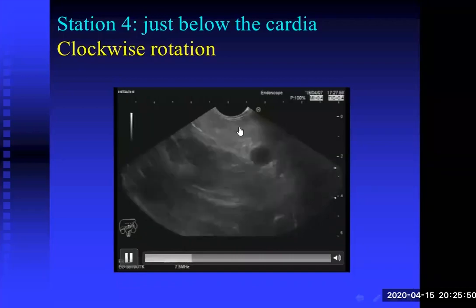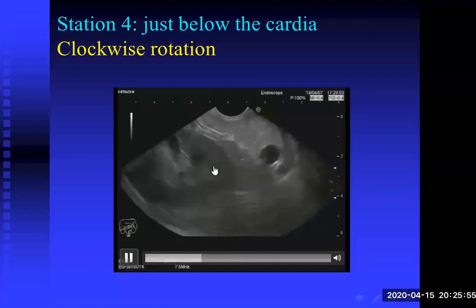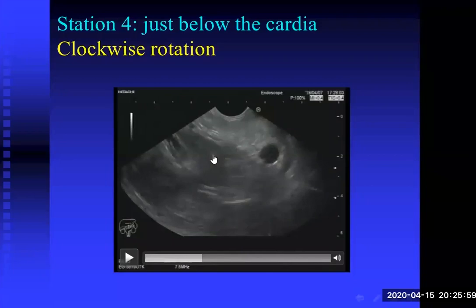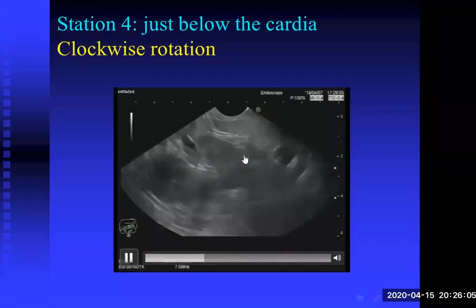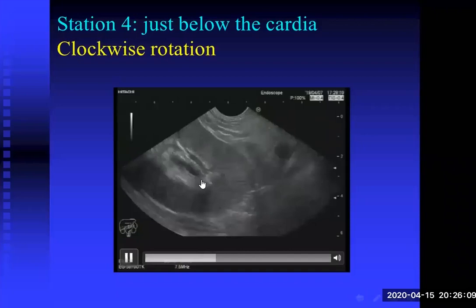This is the pancreatic body. And here, still the splenic vessels, and here coming the left kidney. And there is a small angiomyolipoma, a small benign hamartoma, accidentally seen in this left kidney. Yes, and this is the left kidney, very nicely seen, the sinus and the parenchyma.